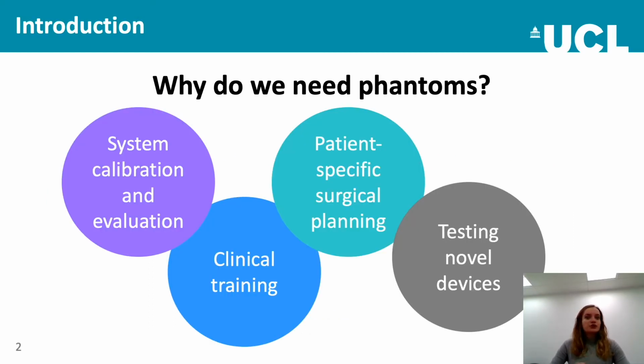As I'm sure you're all very aware, phantoms are vital tools for many applications in biomedical engineering, including the calibration and evaluation of different imaging systems, and for testing and developing novel devices. Clinically, phantoms are also important as training tools and for patient-specific surgical planning. However, the phantoms that are available for these applications often have limitations associated with them.